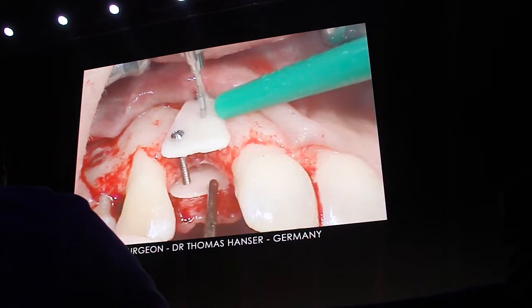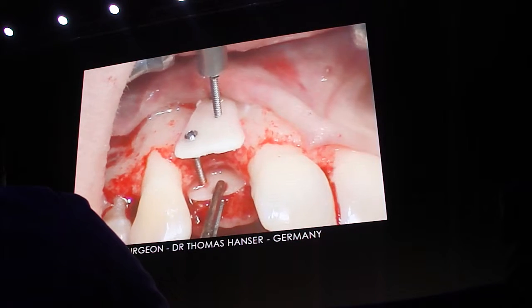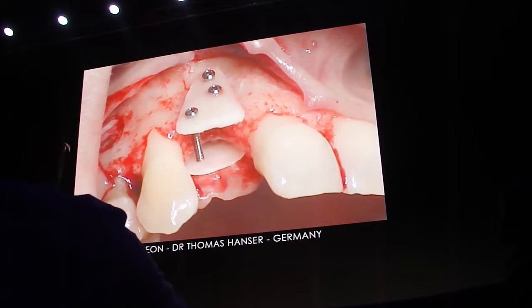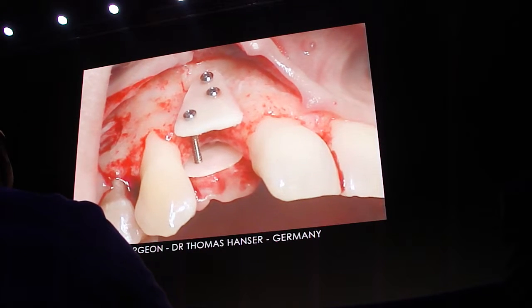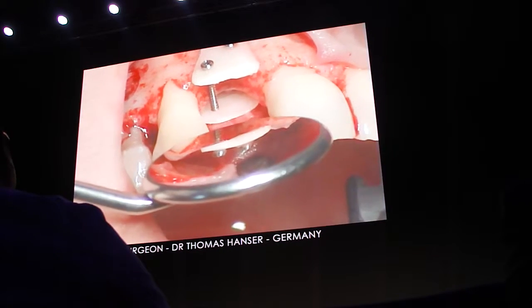So by using this bone membrane technique, we are able to create a very stable biological space, a well-protected area, which is finally filled up with pure autogenous bone chips, all coming from the same donor site. So we see the new buccal wall.